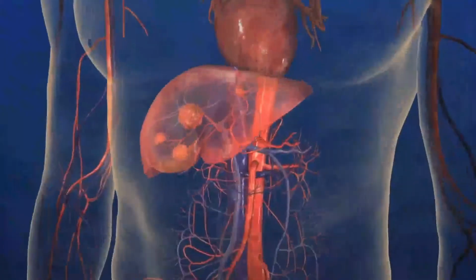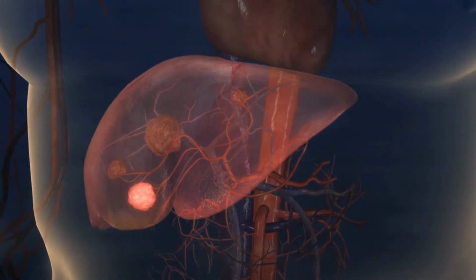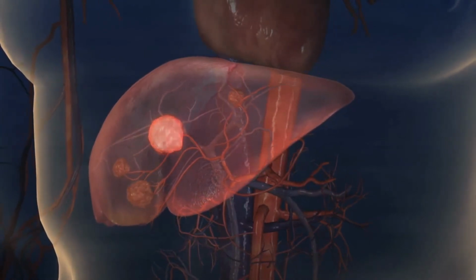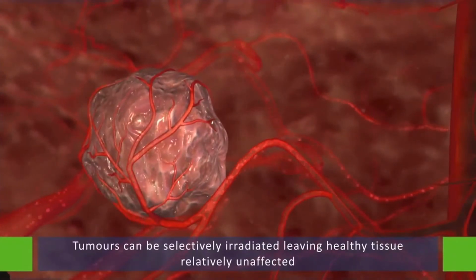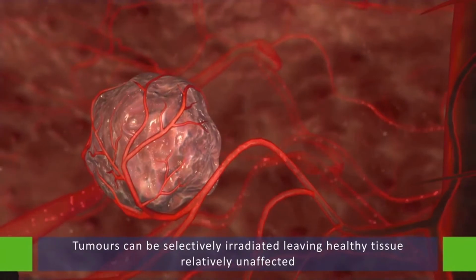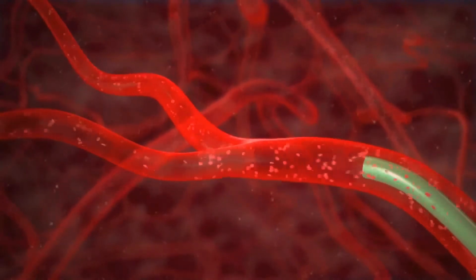We usually have a catheterism of an artery that can be upper limb or femoral artery, and through the catheterism we study all the liver branches. Here you can see the tumors, and the liver is fed by two systems, arterial and portal, and here the lesions are fed by the branches. Then we have the catheterism of the hepatic artery.